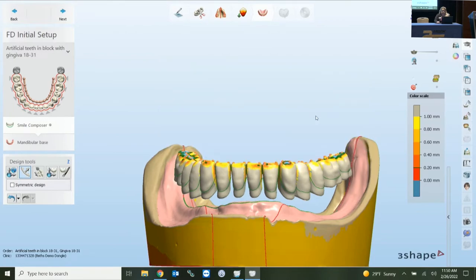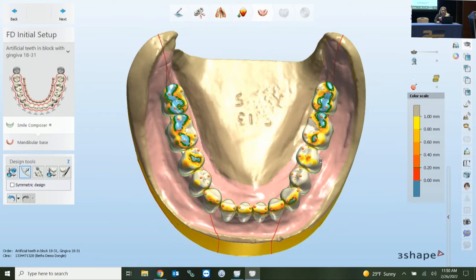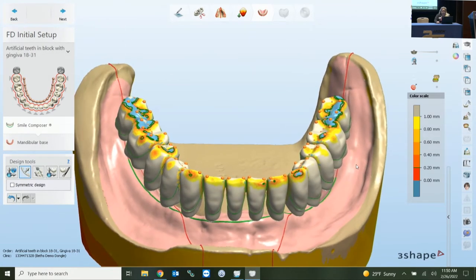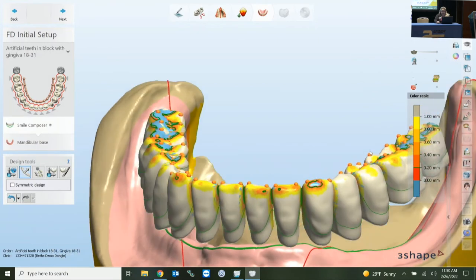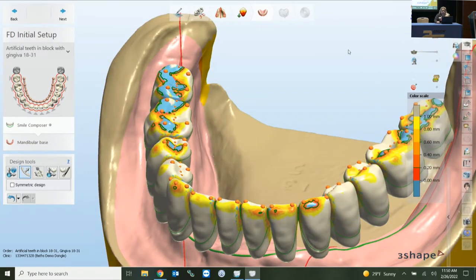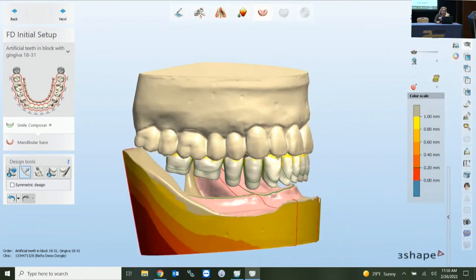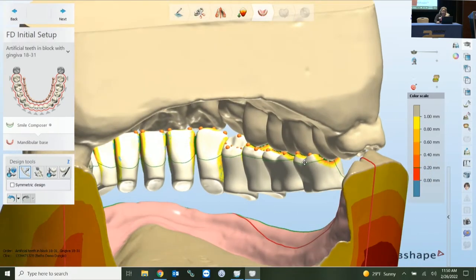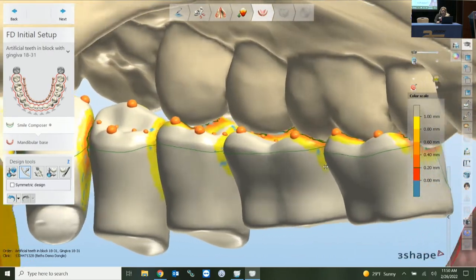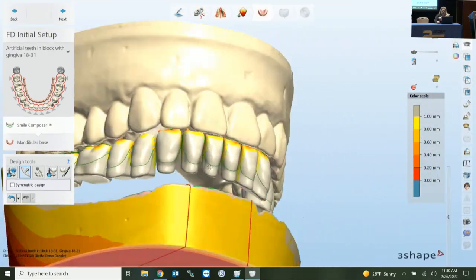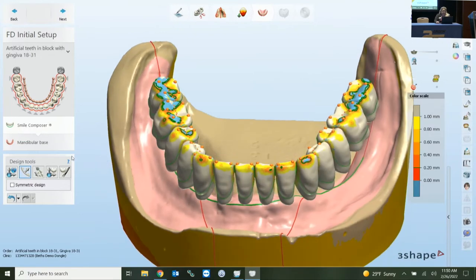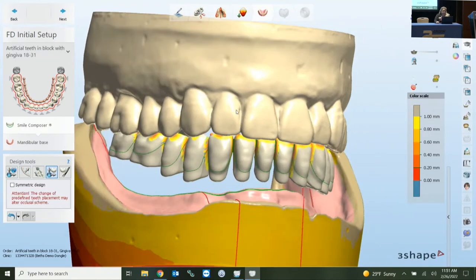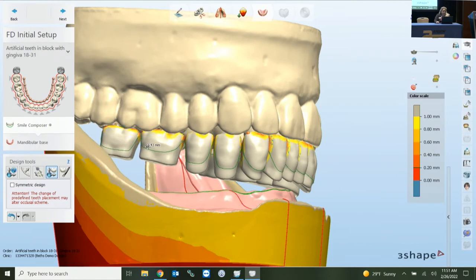Zooming in on the occlusal map, light yellow means not much contact, while blue and green outlines indicate heavy intersection. You can use that color scale to help position the teeth without having your scan visually in the way. Depending on where you are, you can start by making sure teeth are in the right place and then moving them individually, which brings us to the individual setup option.